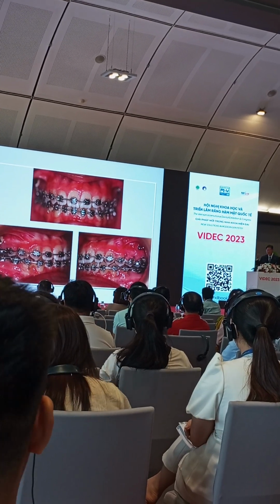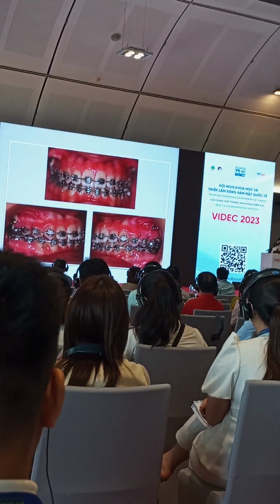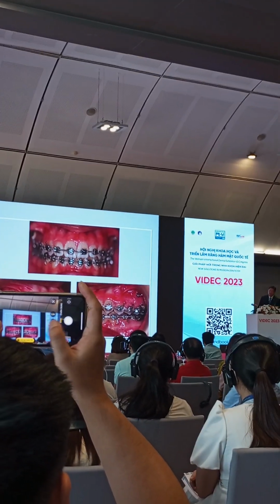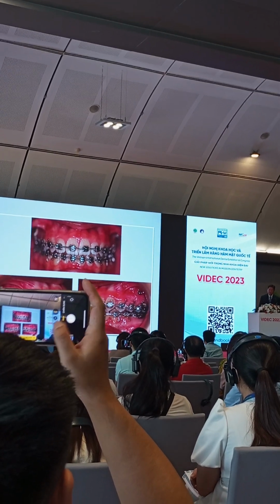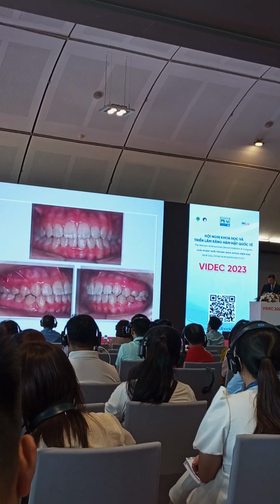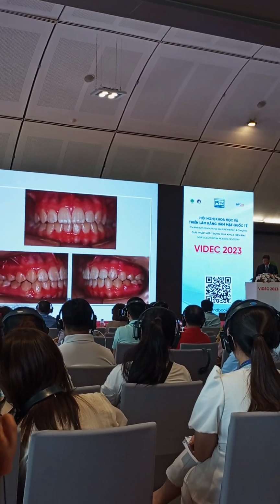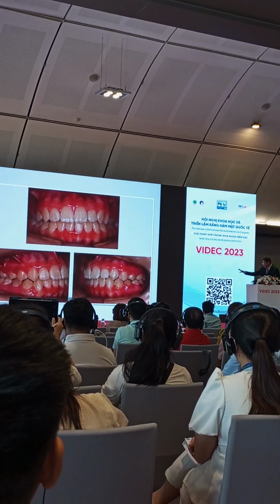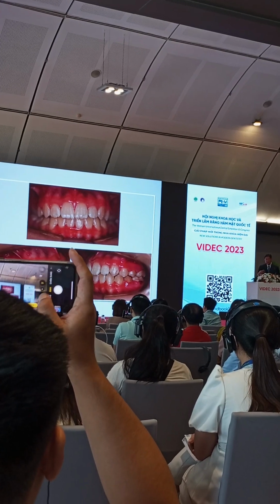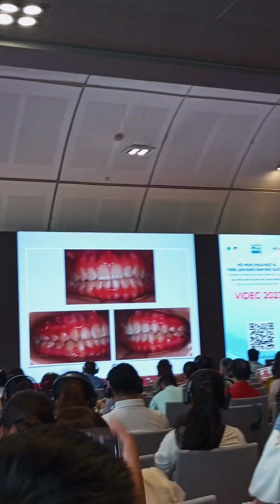So I asked the patient to wear box elastics. Of course, the patient will not wear elastic, because during the time when I asked her to wear elastic during the meaw mechanics, she did not wear. What more now will she wear? So she did not wear elastic. And then I removed the braces, with good overbite and overjet. There is a slight opening on the posterior area, but I will just rely on the normal extrusion of the teeth to interdigitate.